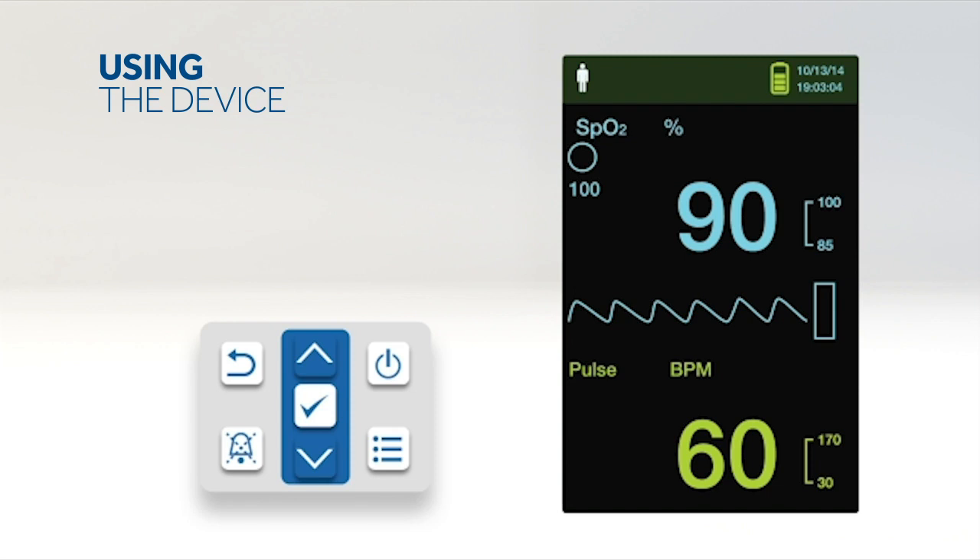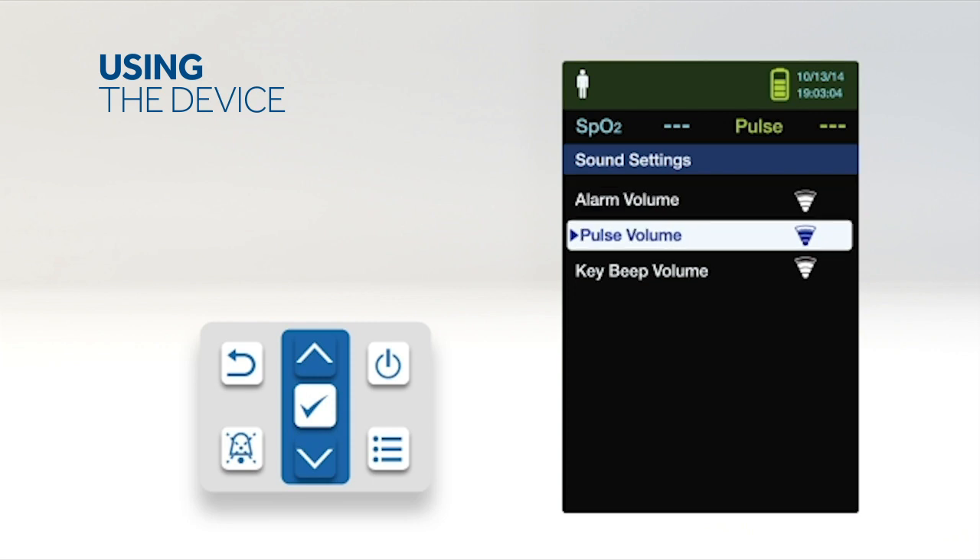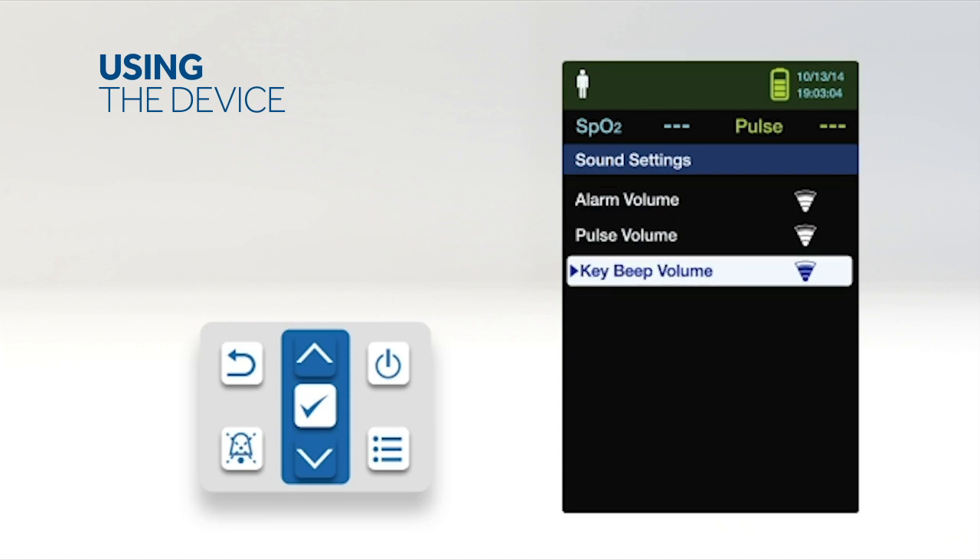To set the desired audible tone volume, select the sound settings menu. Press OK to select alarm volume. Press the down arrow and OK button to highlight and select pulse volume or key beep volume. Adjust to the desired volume level and press OK to save.